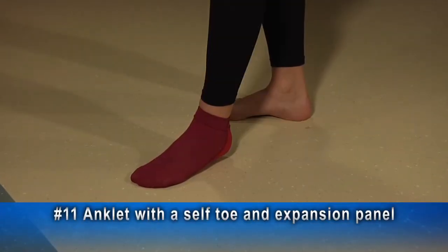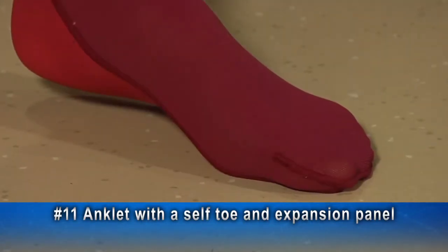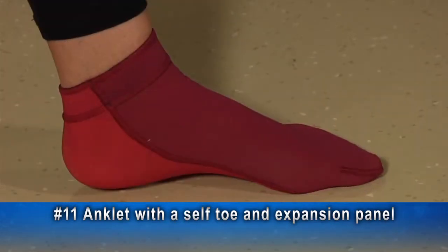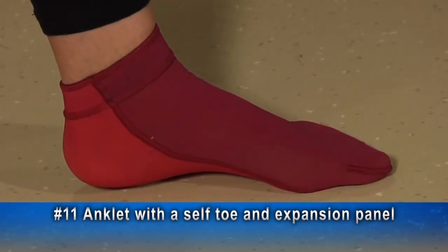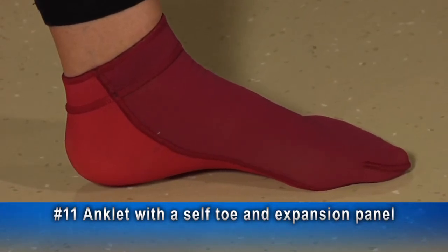Number 11 anklet, a self-toe with an expansion panel. In this self-toe option, the toe box is made from the same fabric as the rest of the foot. By default, on lower extremity garments, the expansion panel is posterior on the leg to the plantar foot.